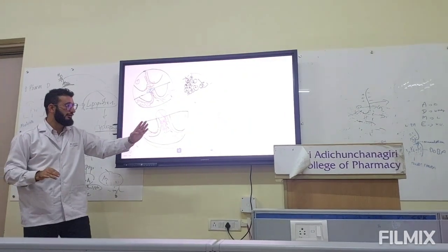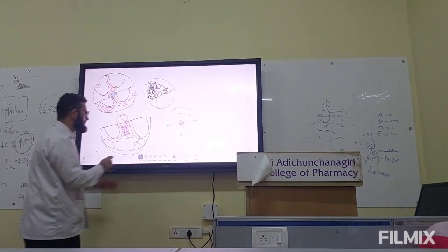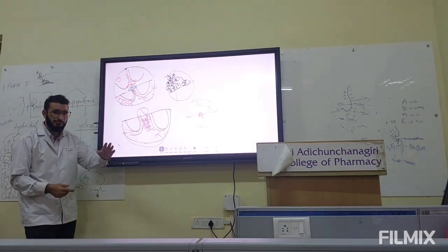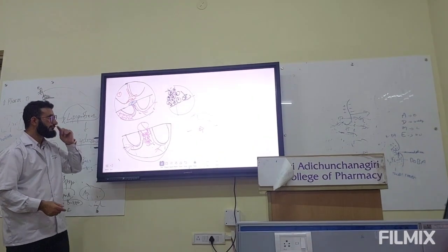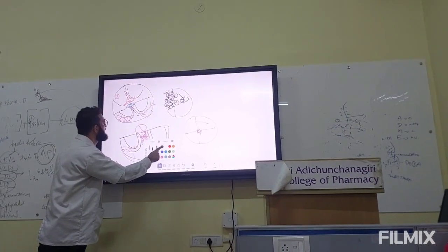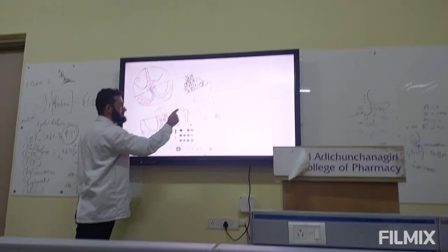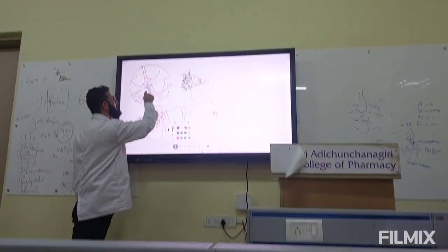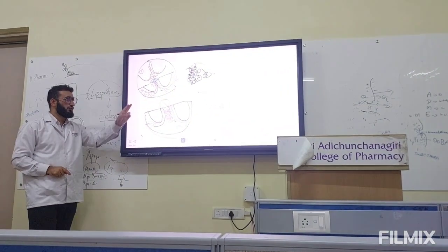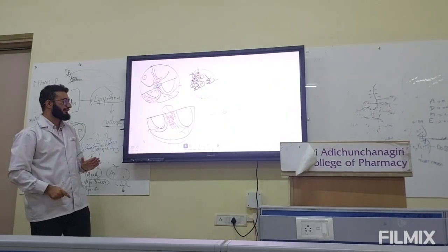It's going to make the direction upwards, carrying positive charge, because the direction of the septal depolarization is from bottom to upward. This is the septal depolarization, carrying positive charge in its head towards the upward area.